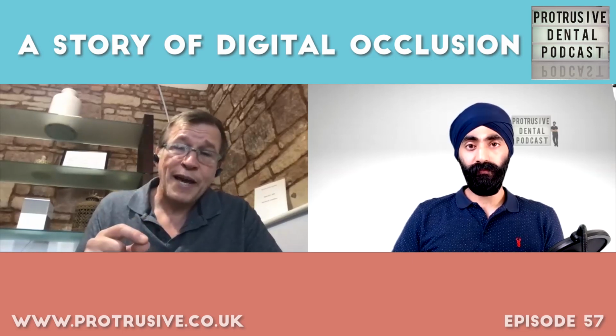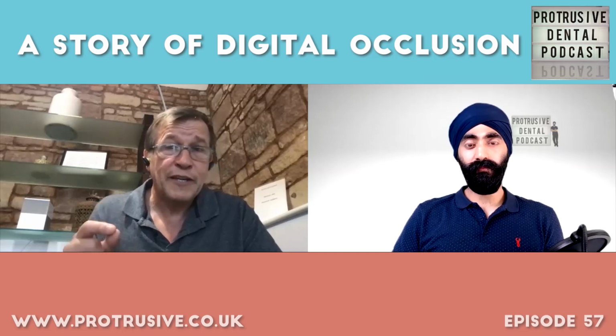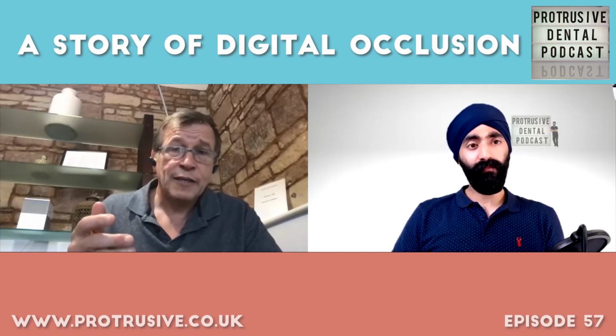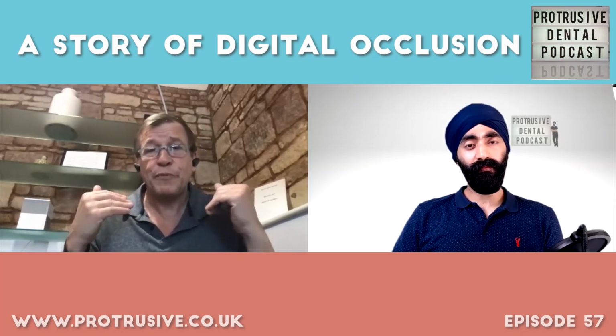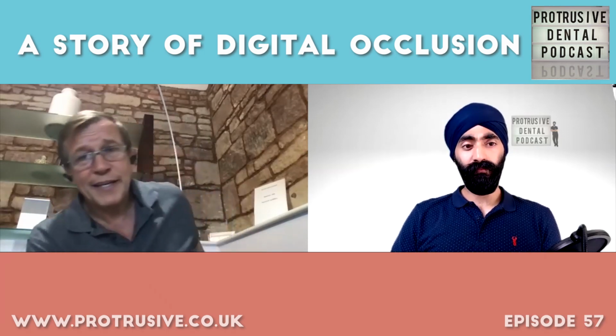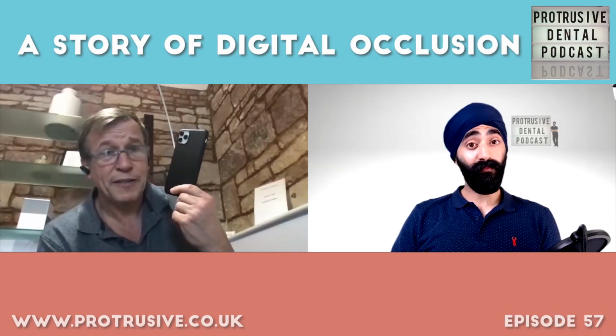So we take a bite at that stage, and then often now we'll take a face scan as well. And the reason why we take a face scan is because the photographs, we can set the patient up pretty well using the photograph. But with a face scan now, I can take my iPhone out and I can take a face scan on this.